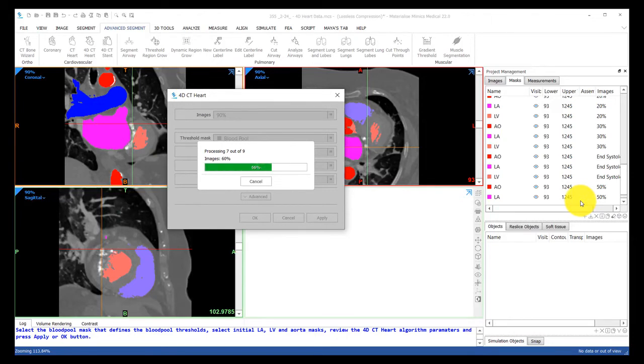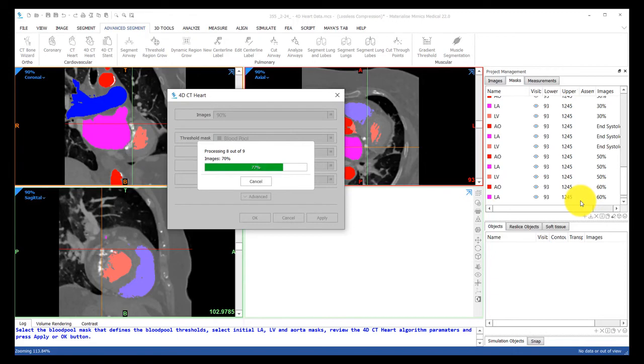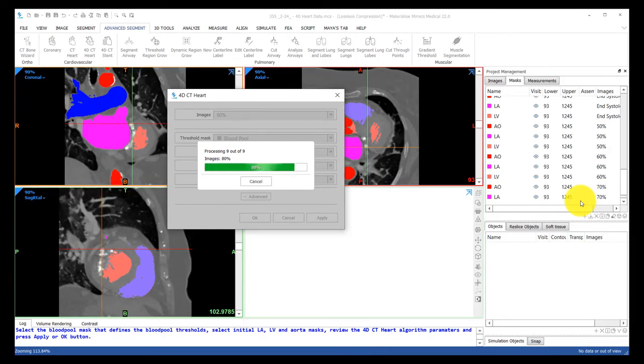Once this is done being hard at work, I'll show you what the masks look like for a random phase. Again, this is only doing the left heart, but you can always have another step where you do the exact same thing for the right heart if you'd like.